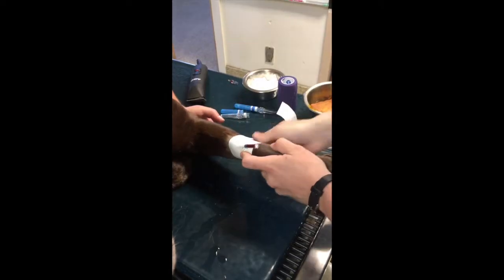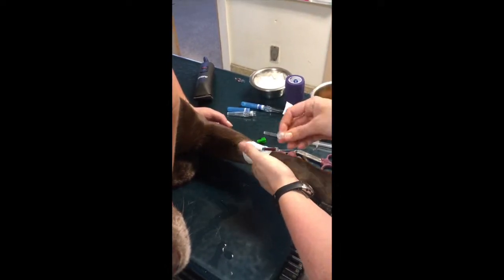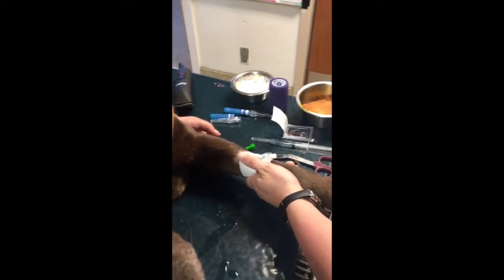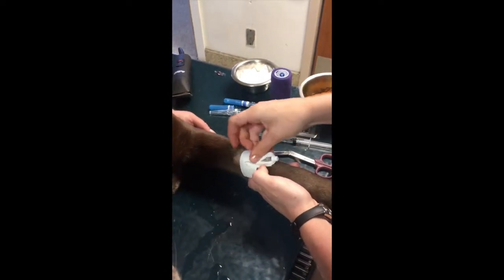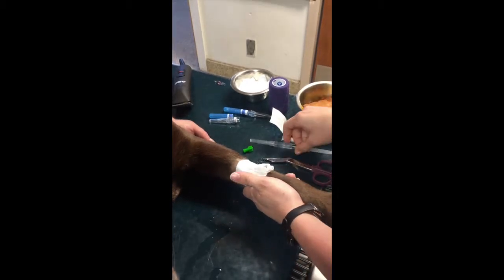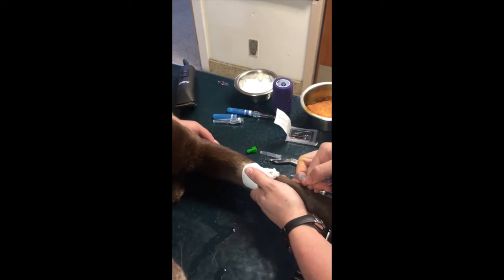Alright, once I have that nice and secure, I'm going to go ahead and put my injection port on the end of the catheter. Then secure the injection port. Alright, once that is done, I'm going to go ahead and give it a flush of saline to make sure the catheter is patent.